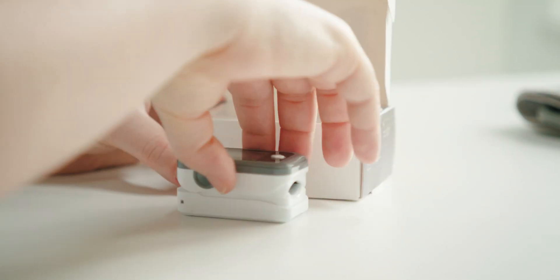Let's take a look at the pulse oximeter device. Again, make sure to install the provided batteries.